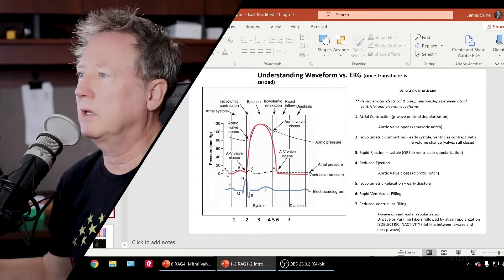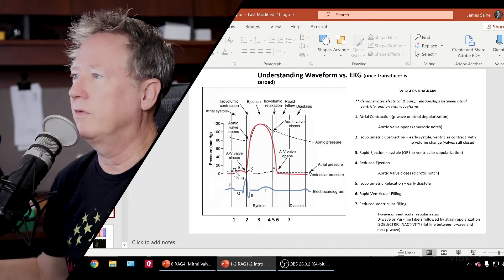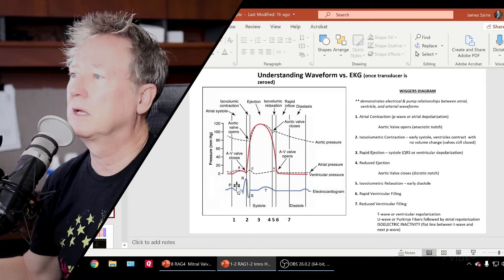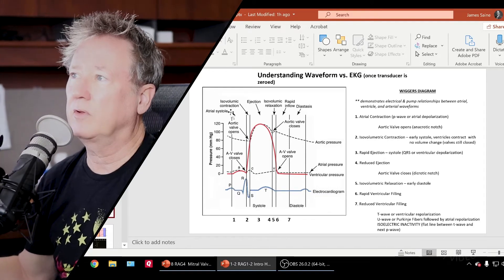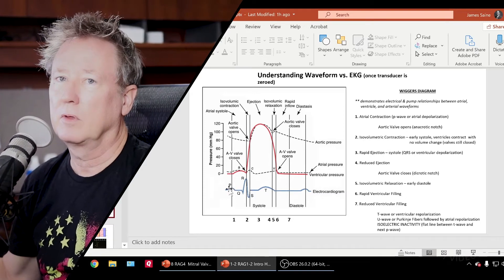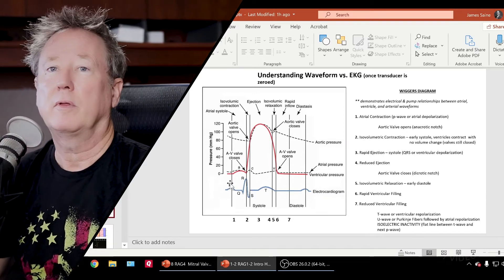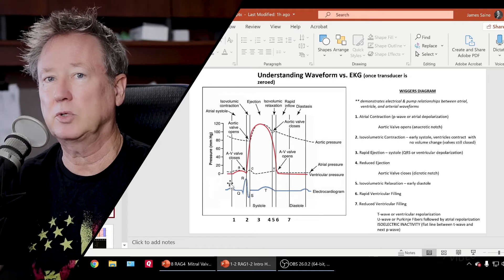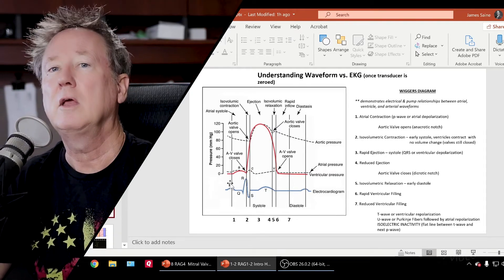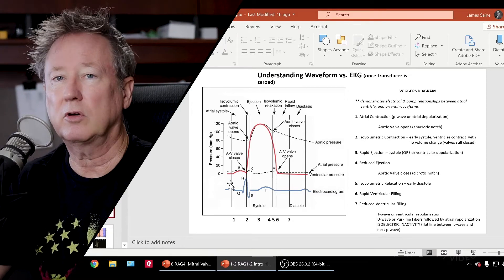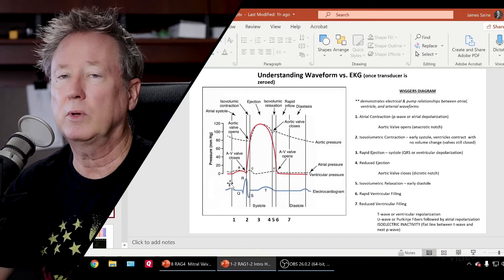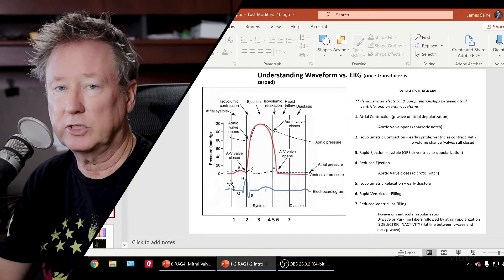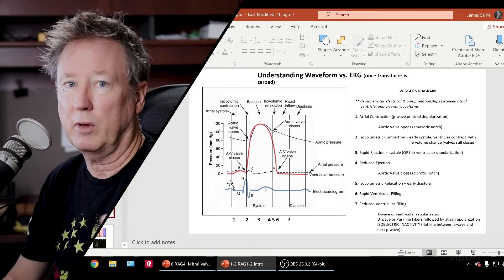We'll be looking specifically at the A wave, C wave, and V wave. It's important to note that electrical activity — for example, atrial systole is represented by the P wave on the EKG — is recorded much faster than a pressure is generated inside the body, transmitted to a catheter, then to a transducer and turned into an electrical signal. So we can record the electrical activity of the heart faster than any pressure generated by the aorta, right atrium, left atrium, or the pulmonary capillary wedge pressure.